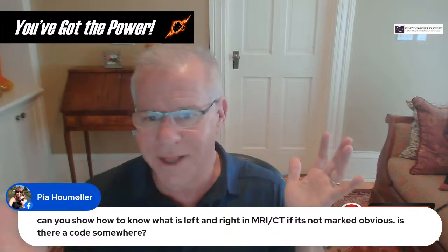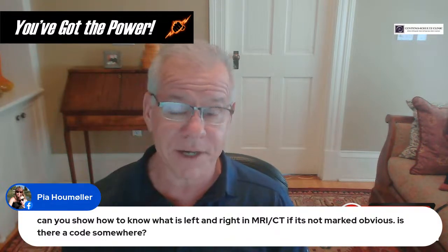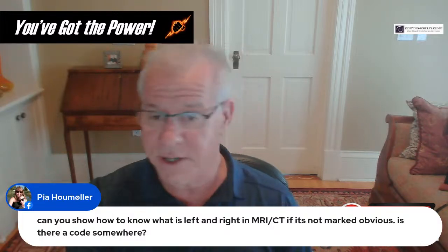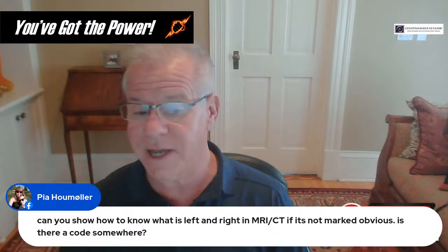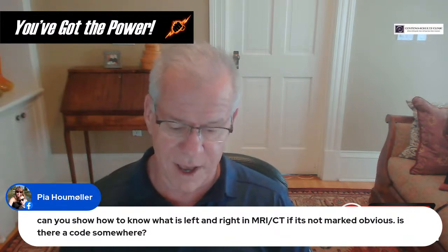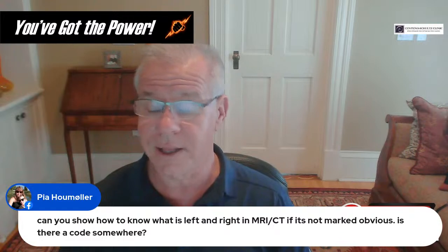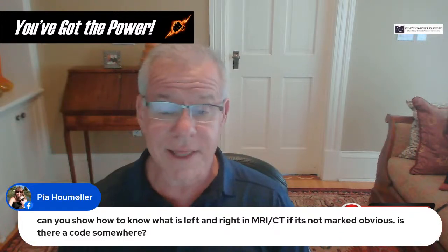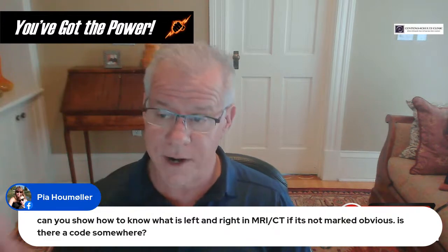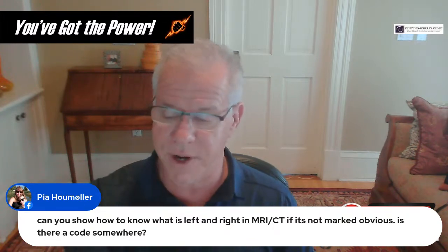I have no idea why they chose to do it that way. It would have been much simpler to put the right of the patient on the right side of the screen and the left of the patient on the left side of the screen. That would have made common sense. But I suspect it's just a holdover from the early days of MRI and how they had it all aligned and arranged. But just realize it's opposite: right of the screen, left of the patient; left of the screen, right of the patient.